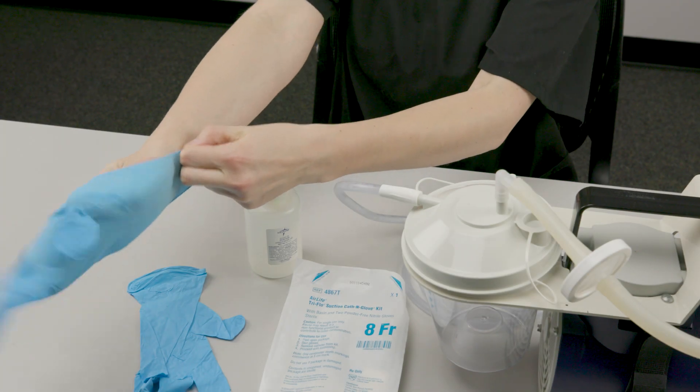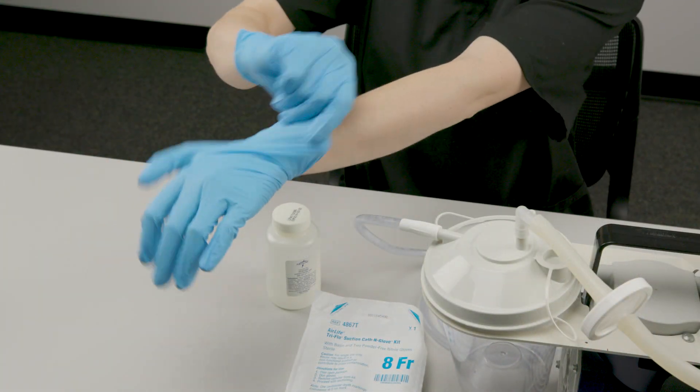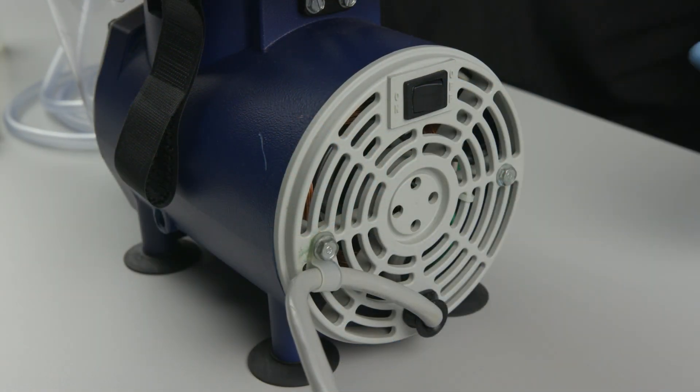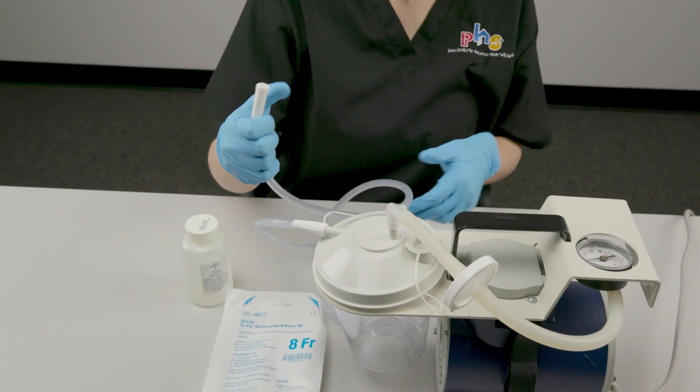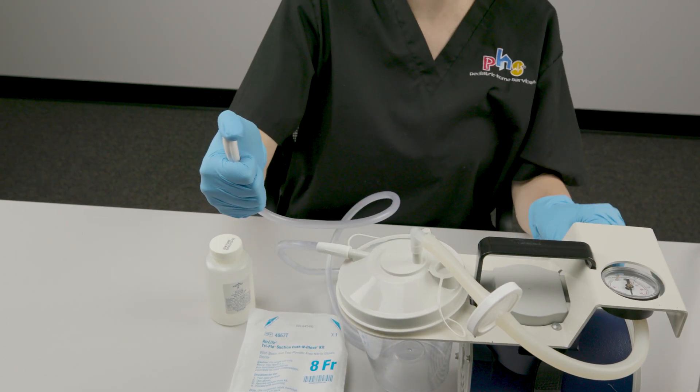Put on the non-sterile gloves. Turn the suction machine on. Check to make sure the suction machine is working and reaches the prescribed suction pressure.